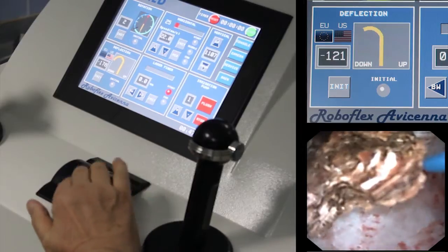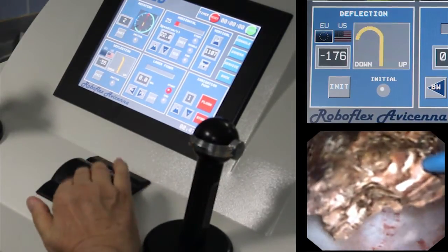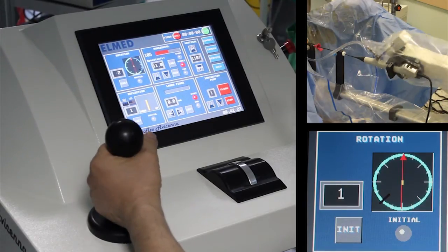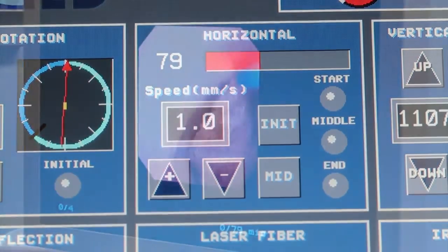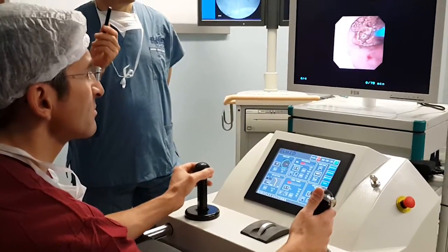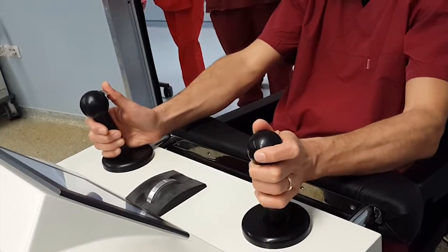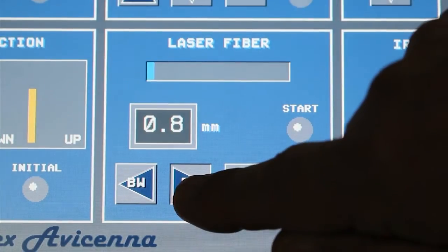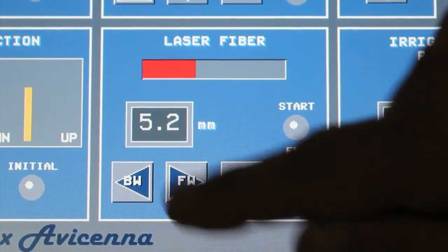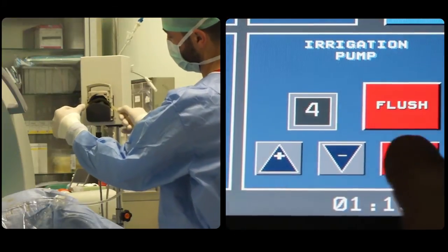For fine adjustments of deflection, a central wheel can be used, especially during precise systematic ablation of the stone. The left joystick allows for rotation of the endoscope as well as advancing and retracting the scope. The speed of rotation and advancement can be regulated on the screen of the console. Once the stone is visualized endoscopically, intracorporeal laser lithotripsy can be initiated, preferably aimed at dusting the stone through precise rotation and deflection of the scope. The laser fiber can be remotely moved in and out.